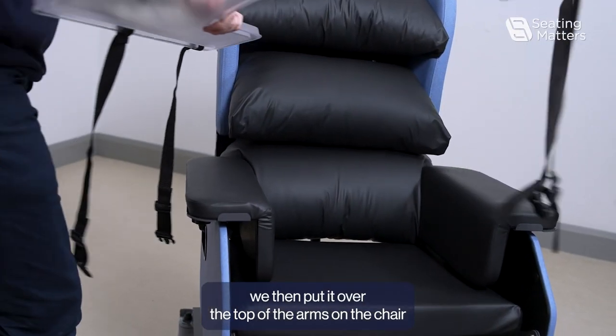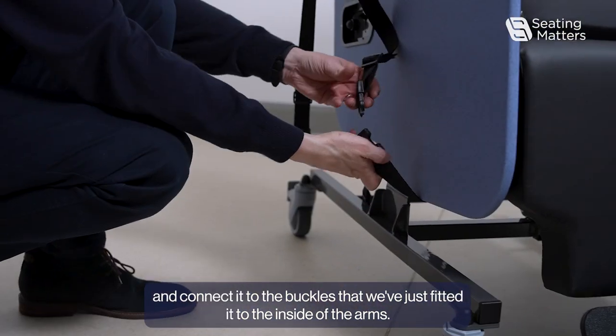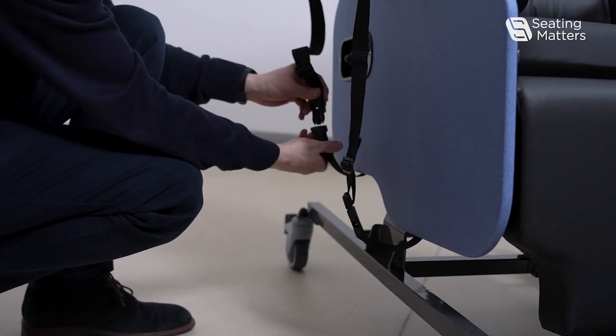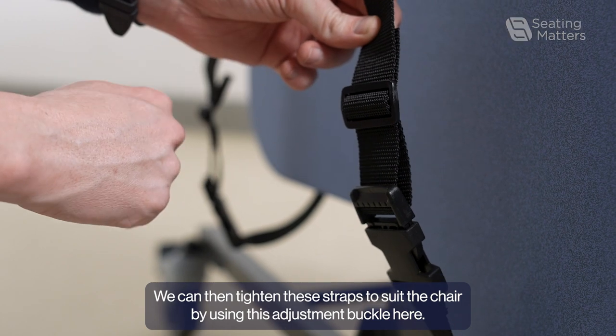To fit the tray, we then put it over the top of the arms on the chair and connect it to the buckles that we have just fitted to the inside of the arms. We can then tighten these straps to suit the chair by using the adjustment buckle.